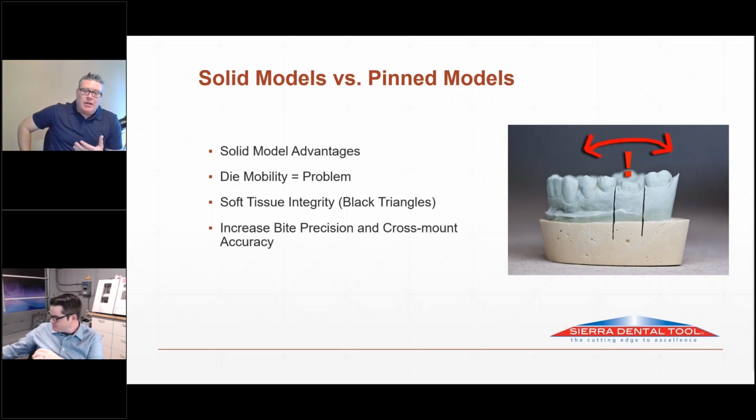The biggest thing is that you want to get everything as clean as possible. You want to have it as natural as it was when they prepped it. What I've seen a lot of times is when the model is cut out and the die is trimmed, and then you go to push the model onto the putty to get it scanned in, you go through all the design work, it gets milled, the guy gets it out of the mill, puts it in the sintering oven.